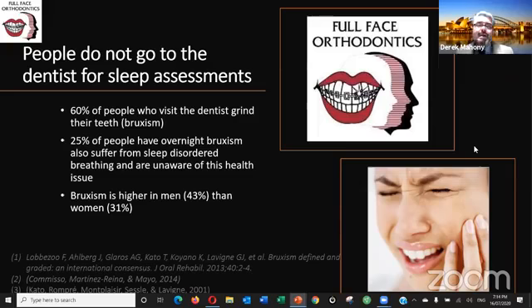Now, here's the problem. You and I have just looked at 100,000 sleep studies, Chris, and when the sleep community looks for bruxism, they detect it with audio and video as their gold standard, but that's not really the gold standard. If you ponder that for a second, it doesn't take long to understand that this gold standard is only going to pick up the worst of the worst, right? If you add EMG to what they're looking at, now you're going to pick up more bruxism.